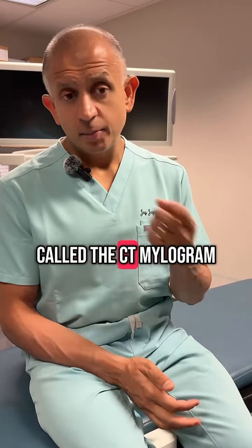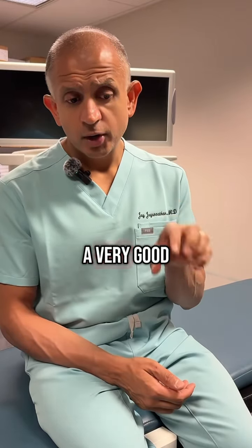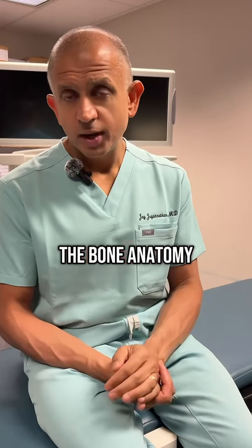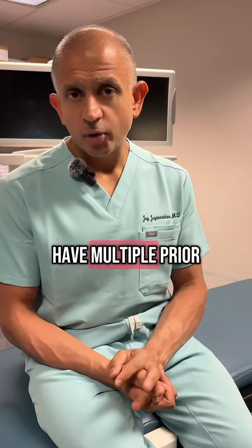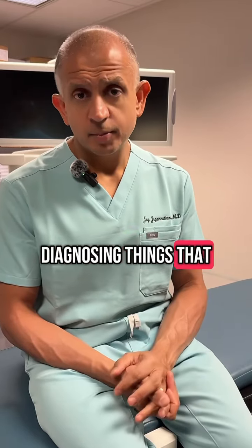There's a study called a CT myelogram where you inject a little bit of dye into a CT scan, and that also gives you a very good idea of the neural anatomy and also at the same time the bony anatomy. So in complicated cases, for example, when patients do have multiple prior surgeries with scar tissue, a myelogram can be very useful in terms of diagnosing things that can be missed on MRI.